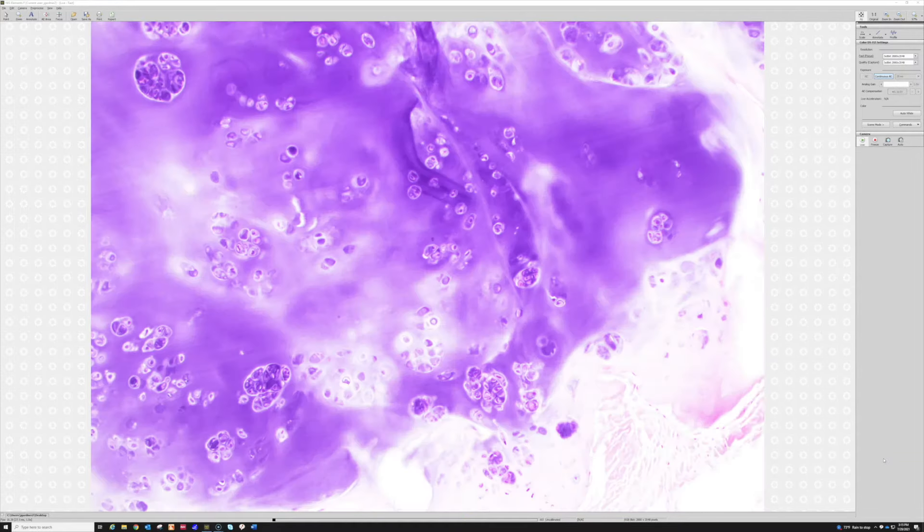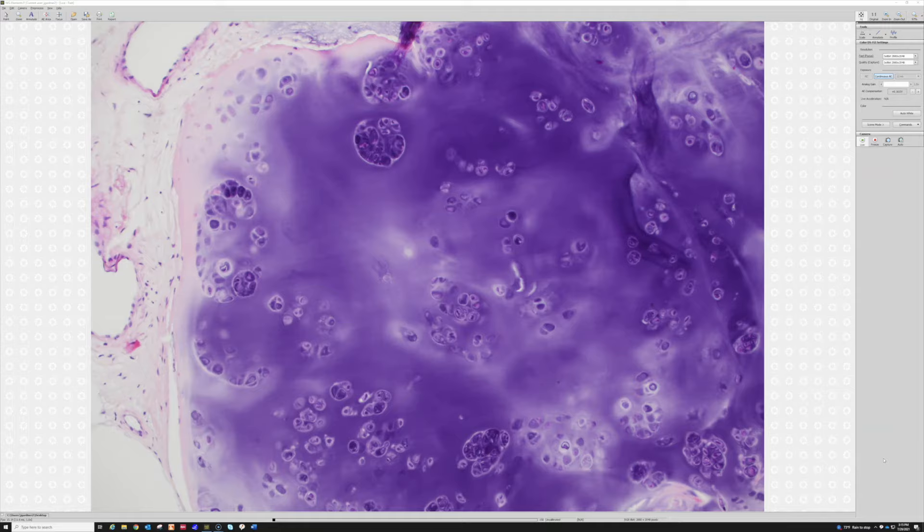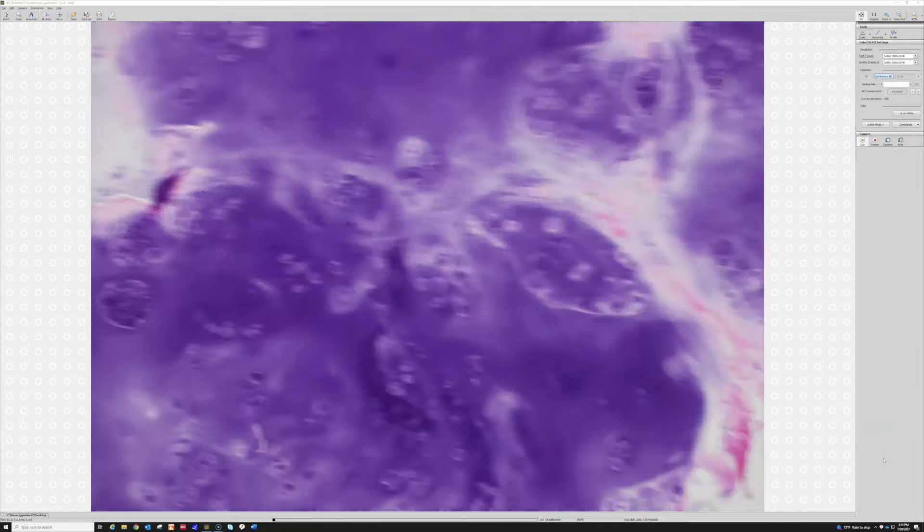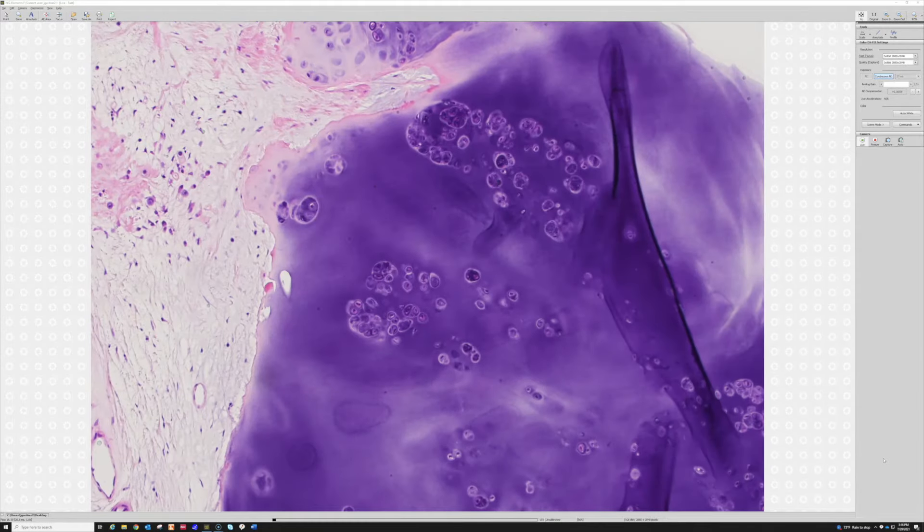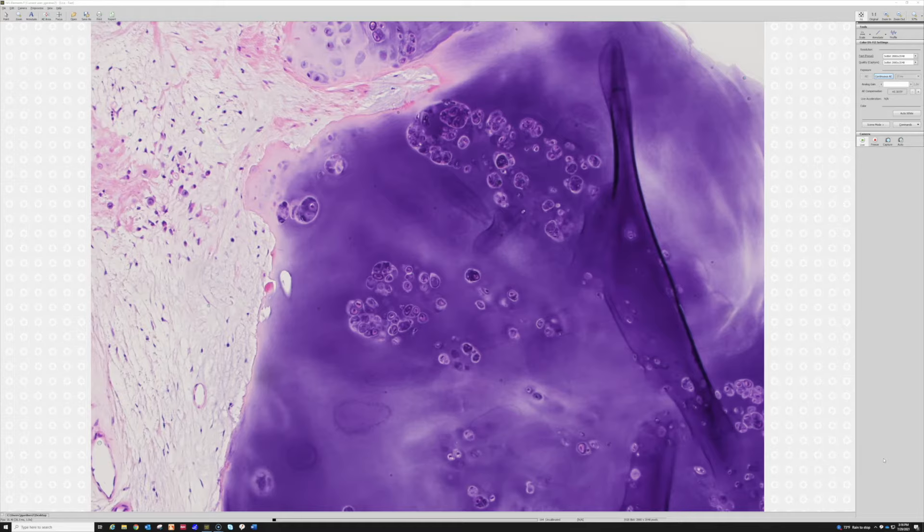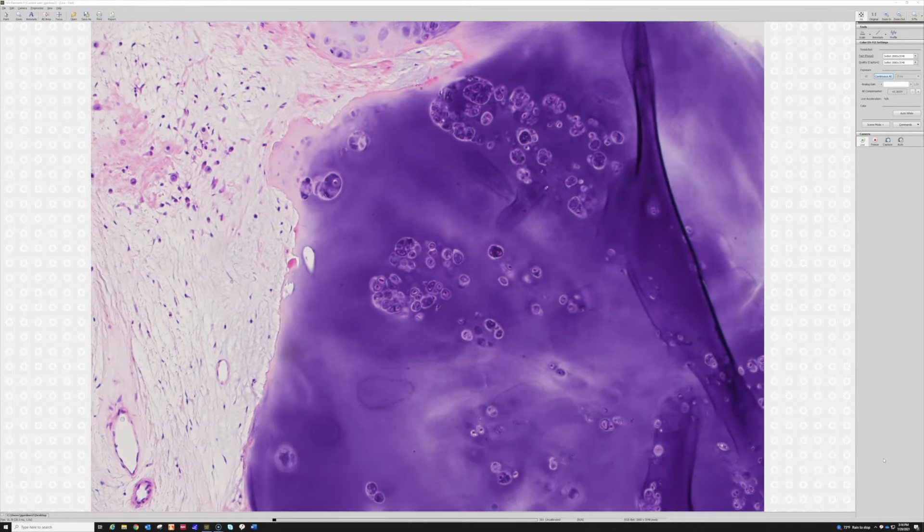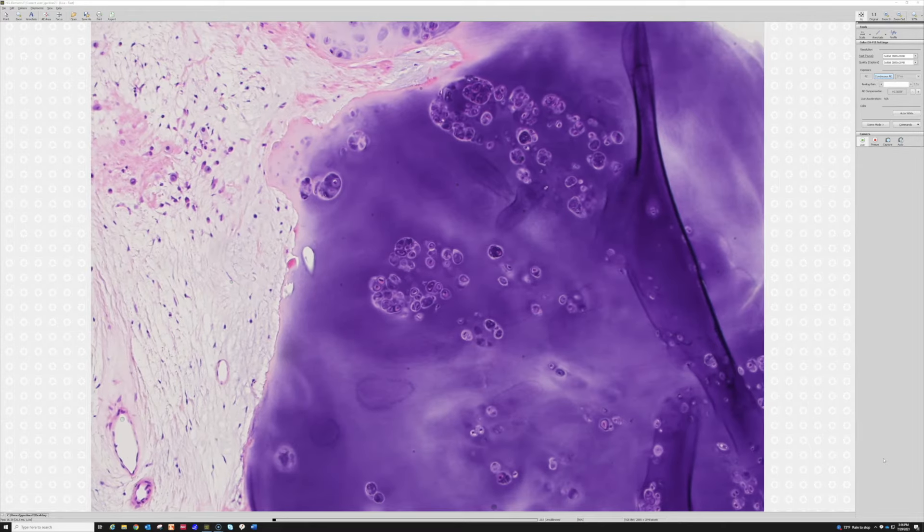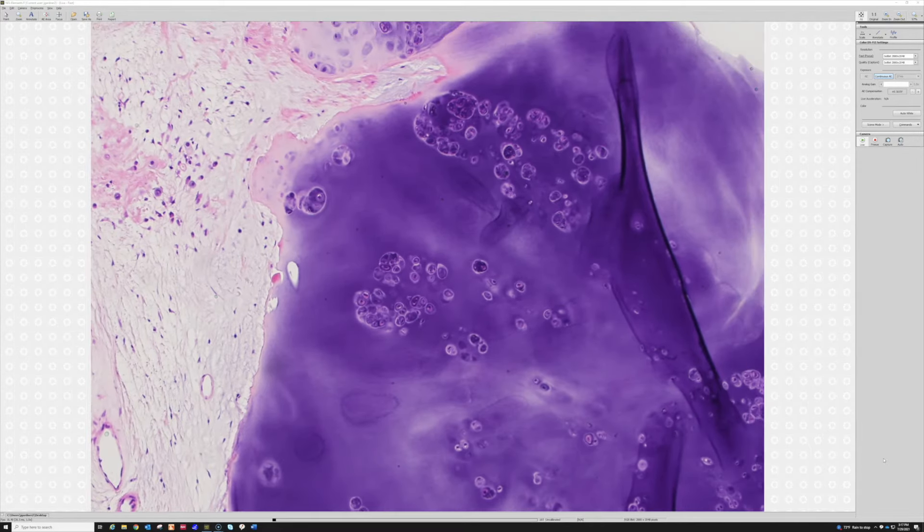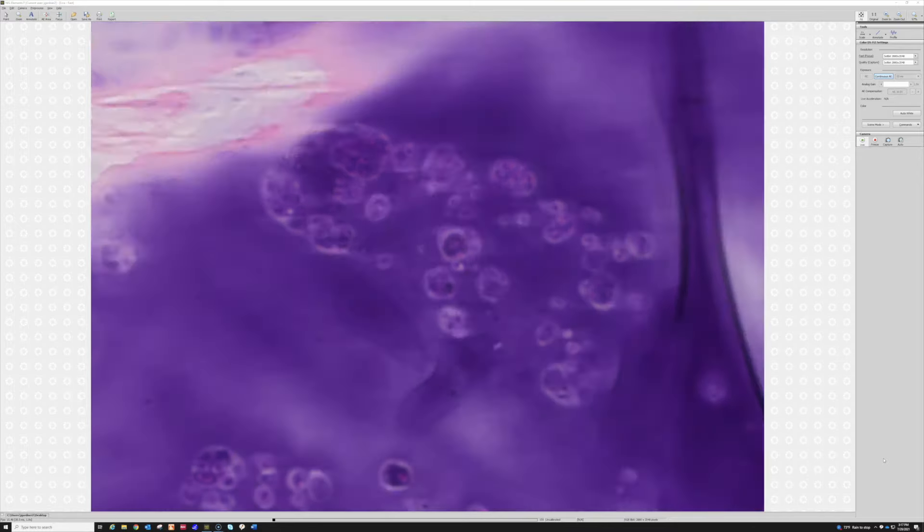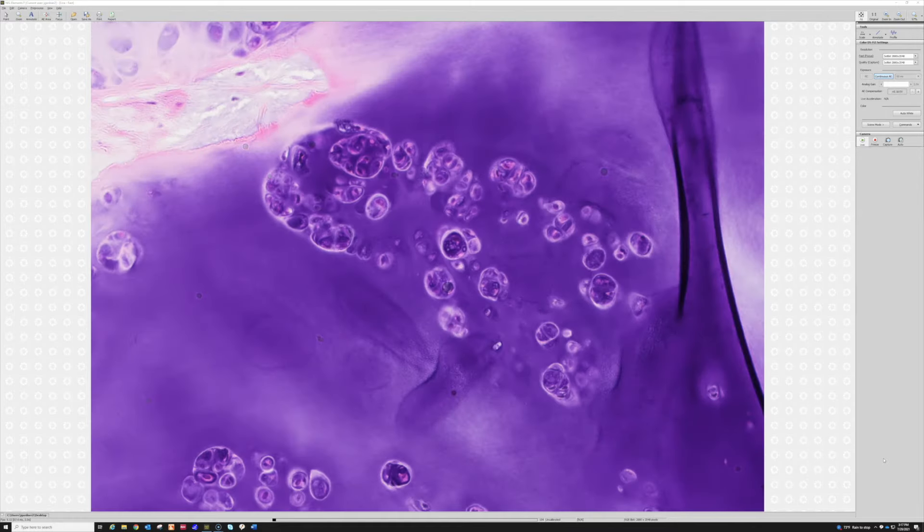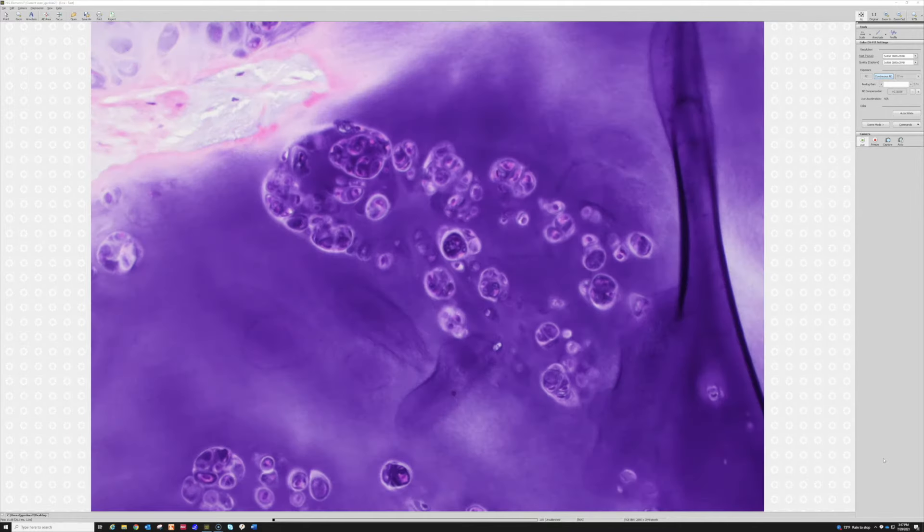This condition is called synovial chondromatosis. Very good, this is synovial chondromatosis. One thing that helps me is that I've got multiple little islands like I showed you from low power. The other thing is that when you get closer, the cells cluster into these little proliferative islands or nodules or clonal islands. You can see some of this clustering in reactive cartilage, like in osteoarthritis or degenerative joint disease occasionally.